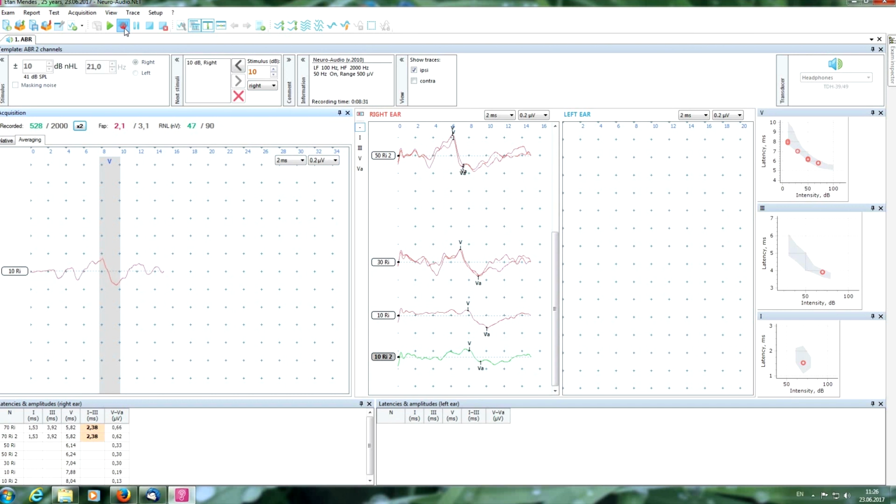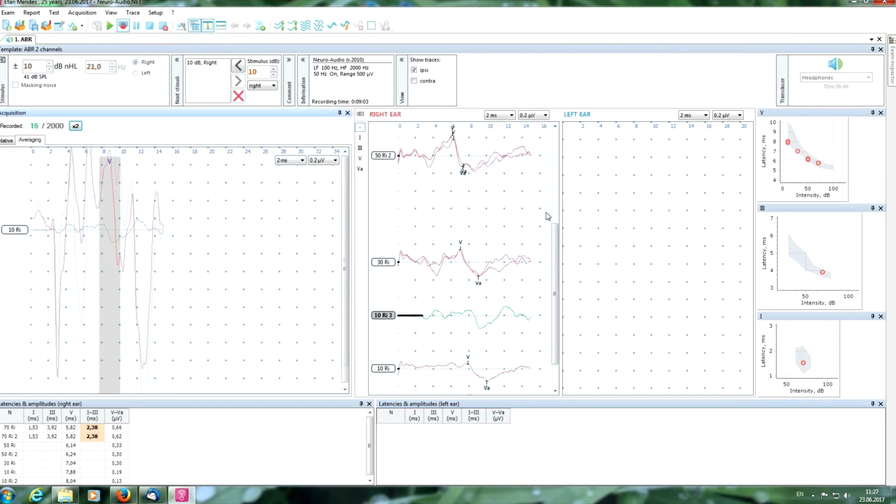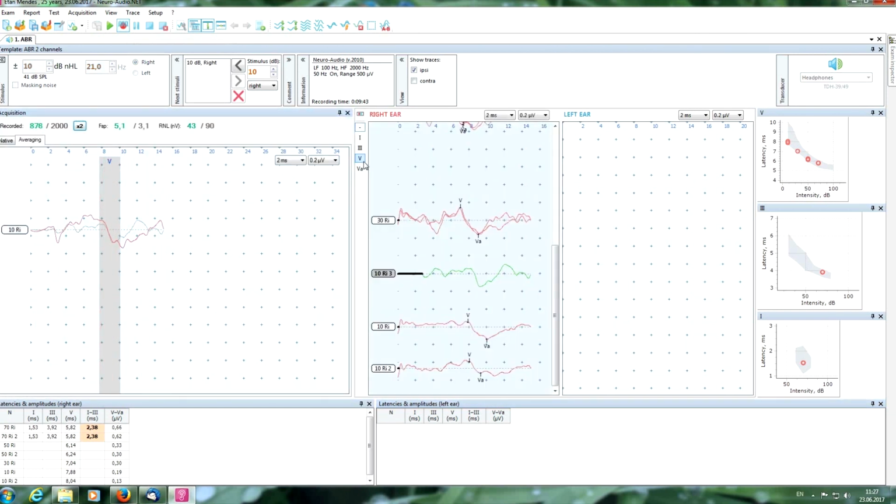We can see the process. As you can see, we use only 1000 averaging now, and we get the 5 wave on this quantity. We can stop and repeat. You can see the good reproducibility. It is a 5 wave, not noise. We have good statistical parameters of signals, and we can stop.